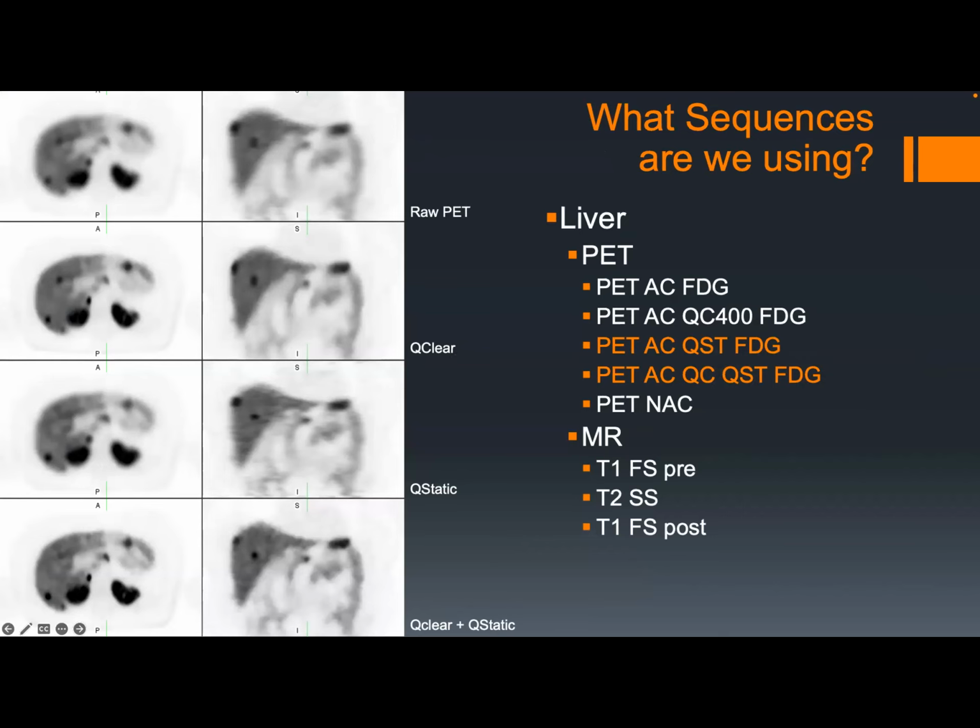For our liver focused or any region focused exams, we use the same diagnostic sequences. So, high res T2s, TSE T2s, diffusion. For our livers, we're getting MRCPs. So we're getting the full MR experience for these patients. It's not like we're leaving anything out.